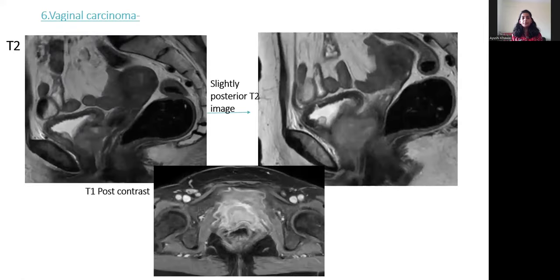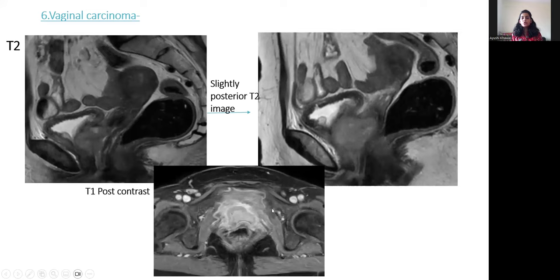Sixth case: vaginal carcinoma. On T2, there is a mass involving the anterior wall of the vagina. A slightly posterior T2-weighted image shows the large mass also involving the posterior wall of the vagina. On post-contrast images, the mass is strongly enhancing with lymph node involvement.